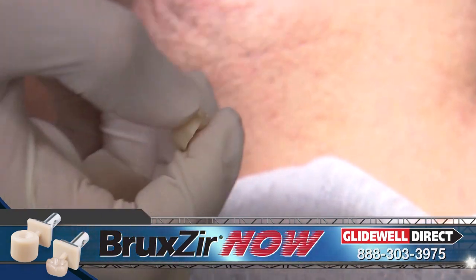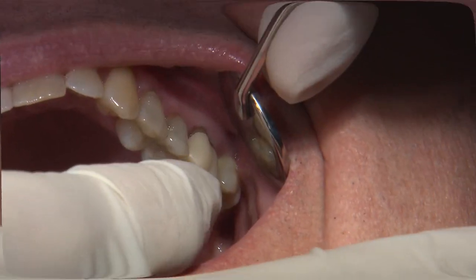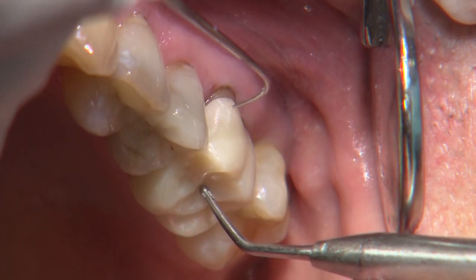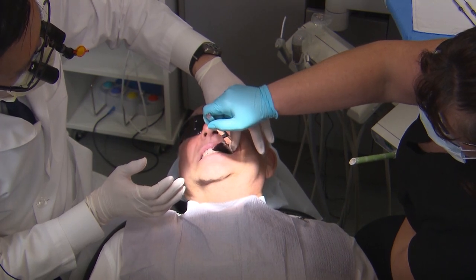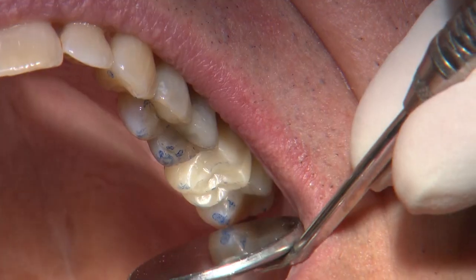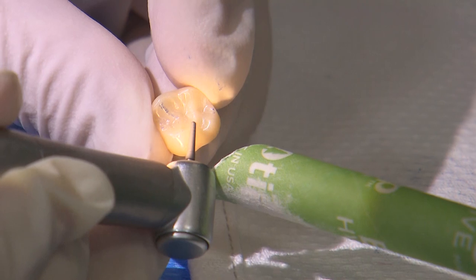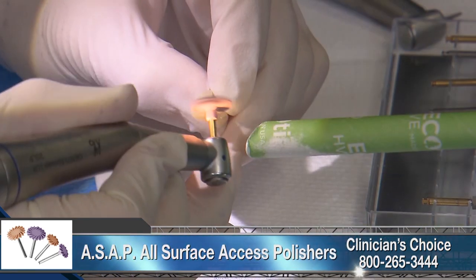On the milled Bruxer, I snap the crown at the thinnest point of the sprue and smooth the residual down with a fine grit red-striped diamond bur. I'll then seat the crown and check the proximal contacts. Since I've found a contact value in the software that works for me, I normally have very little to no need to make adjustments. After evaluating the margins with an explorer and a bitewing radiograph, I'll check the bite for any heavy contacts. When making adjustments to lab or chairside Bruxer, we recommend using fine grit diamonds to limit surface roughness. Following any adjustments, polishing the restoration is recommended, and here I'm using the ASAP polishing kit by Clinician's Choice, designed to work well on any restorative material.